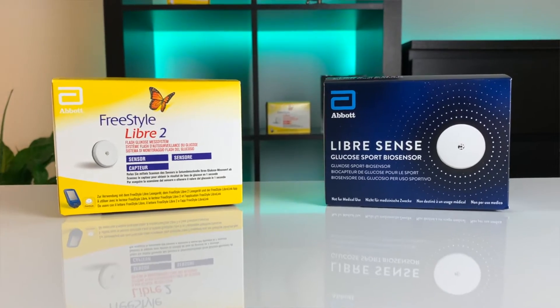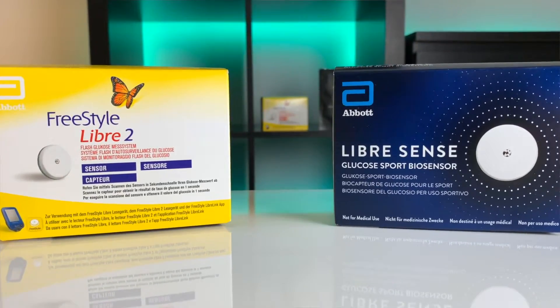For the past six weeks I have been testing and comparing two CGM sensors: Freestyle Libre 2 and LibreSense BioSensors. In this video I'm going to share what I found out and which one I like better and why. So scan your sensors and let's go.